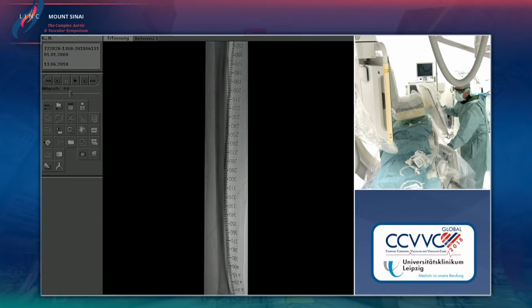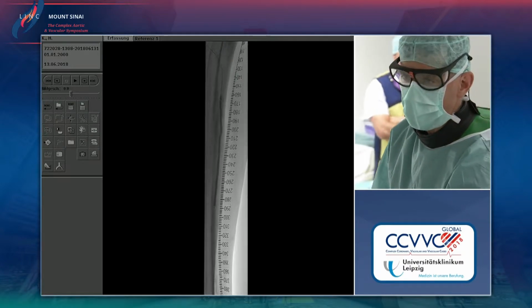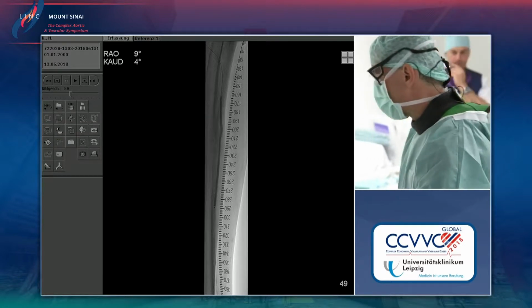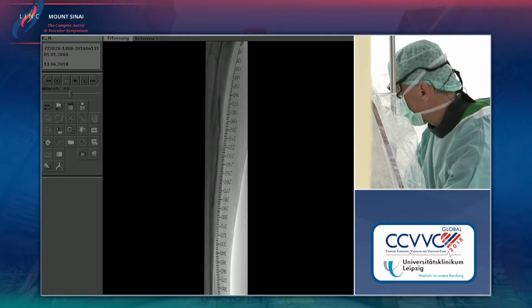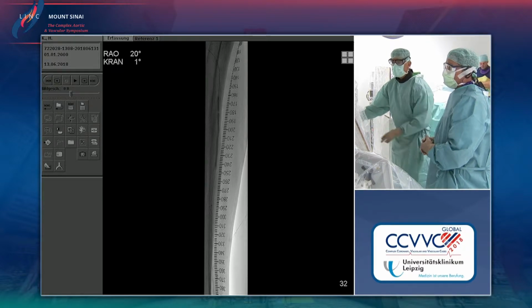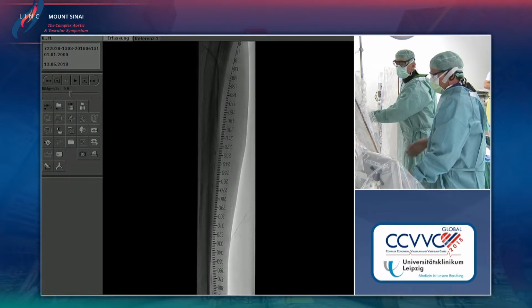So it really depends. 2.5 was not so painful for the patient distal, but here in the proximal part, it is even more painful at lower pressure. This is really sometimes interesting. I think it may also depend on the severity of the calcification, pressing maybe more calcium outward. And probably depending also where you are located with your balloon, if you are in the true lumen or subintimal, that's also predictive for pain. Proximally it was definitely intraluminal, because there was a little more pain.